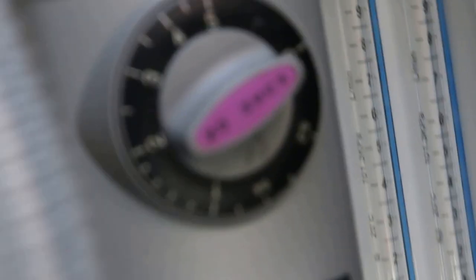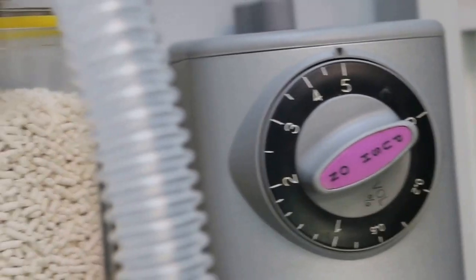Ok, few seconds, take it out from here, take it out from this. Ok then I use electrosurgery.